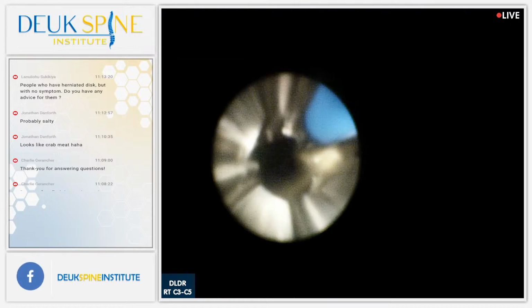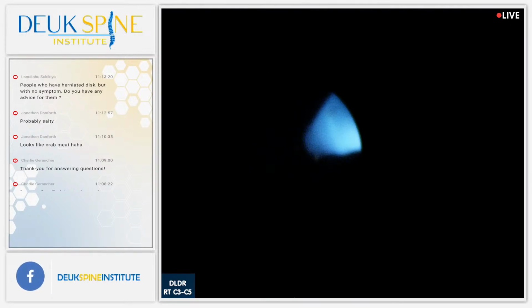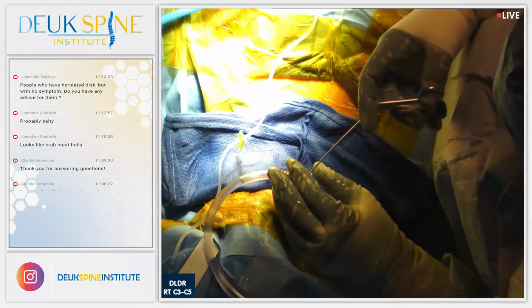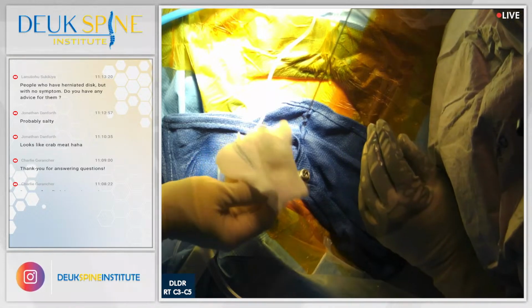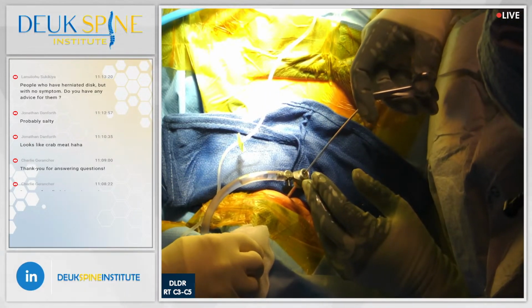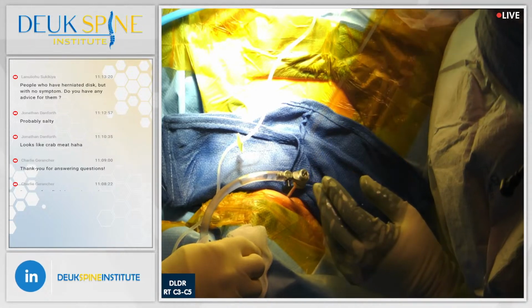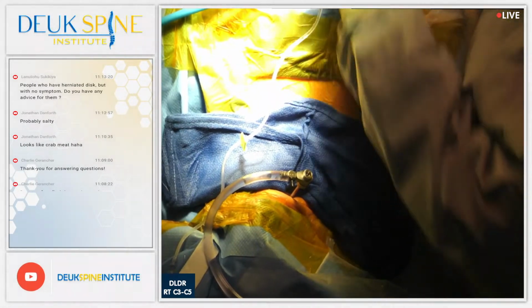Let's see if I can grab that out because it's just sitting there at the bottom. Nope. No luck grabbing it out.